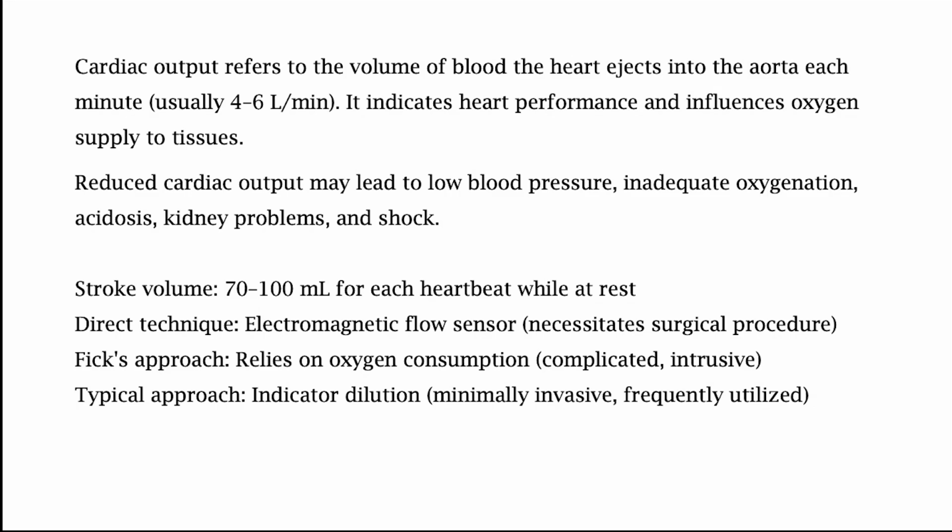I could put an electromagnetic flow sensor inside and measure near the aorta. But that means I have to open up or find a way to do this invasively. The other is the Fick approach. This approach, we'll discuss the detail of how this works.